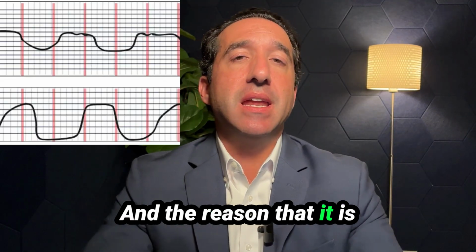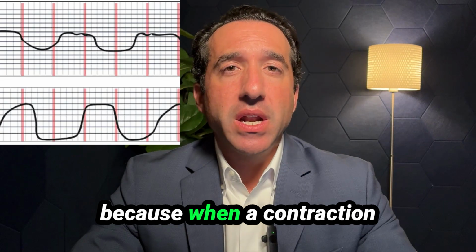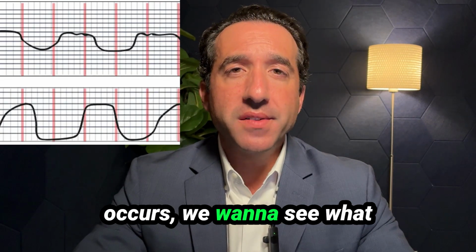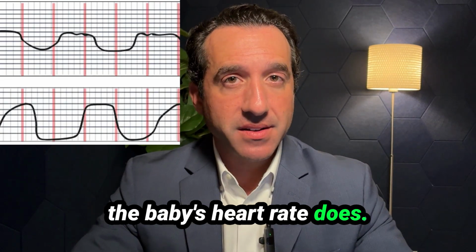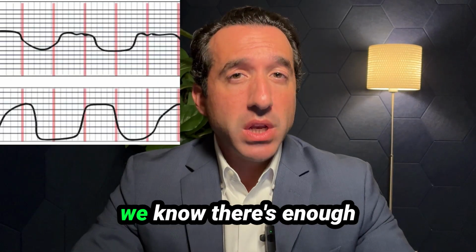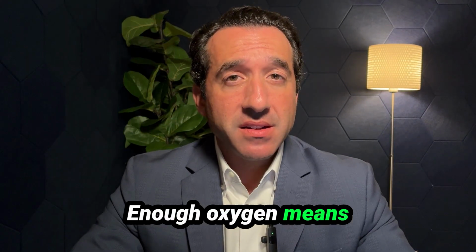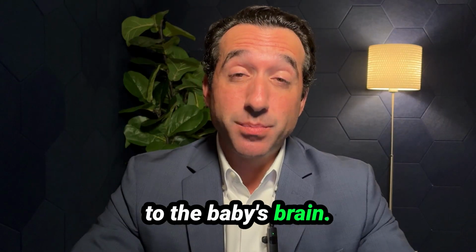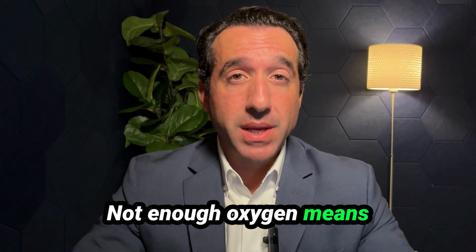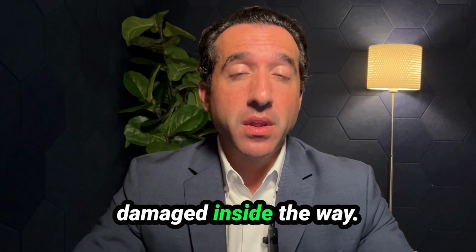And the reason that it is important for them to be measured at the same time is because when a contraction occurs, we want to see what the baby's heart rate does. If the baby's heart rate responds accordingly, then we know there's enough oxygen getting to the baby. Enough oxygen means enough oxygen is getting to the baby's brain. Not enough oxygen means the baby's brain is getting damaged inside.